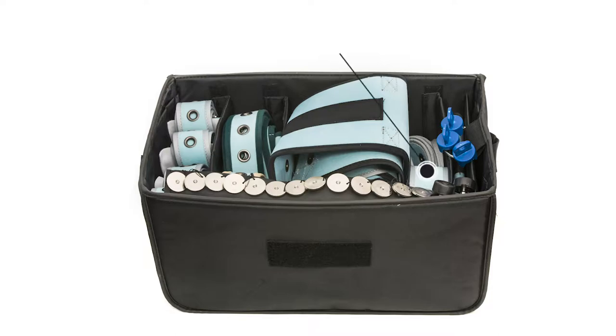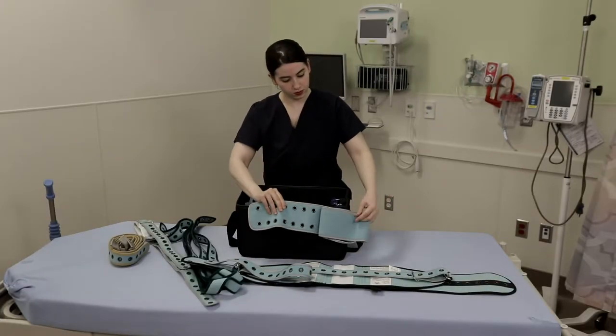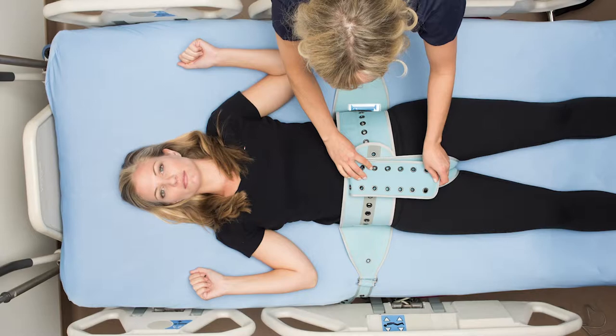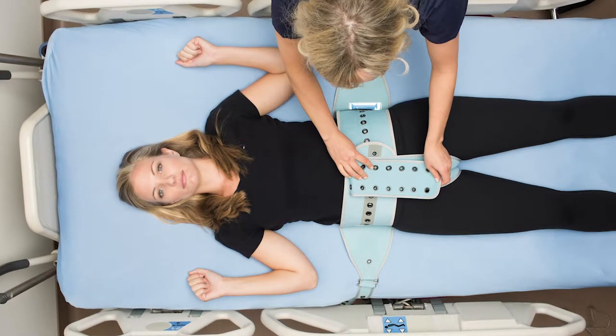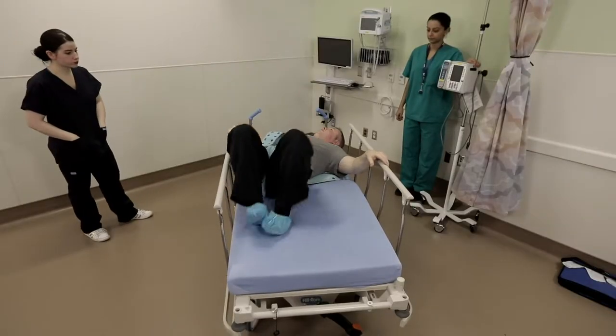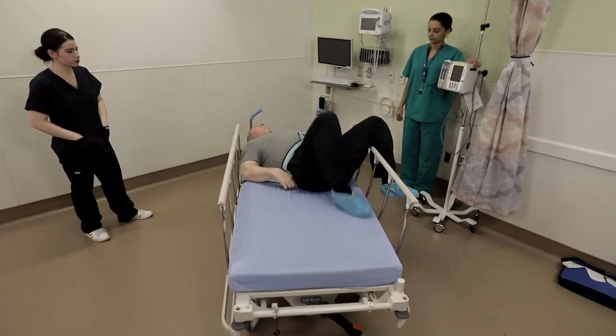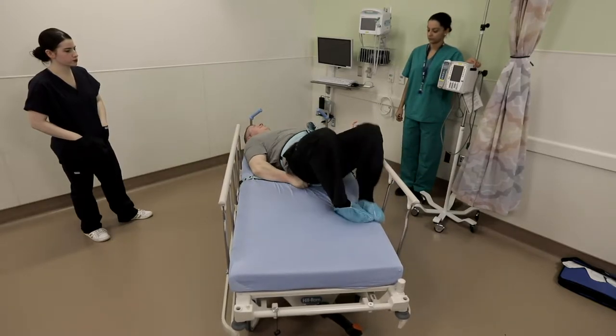The next slot contains one pelvic strap. It is a simple but very powerful safety device attached to the waist belt for either chair or bed use. The pelvic strap prevents the waist belt from being pulled upwards over the thorax, where it can cause chest compression and possible asphyxiation during a bed egress attempt. Since it is in an area of frequent soiling, it is easily removed to allow separate cleaning.